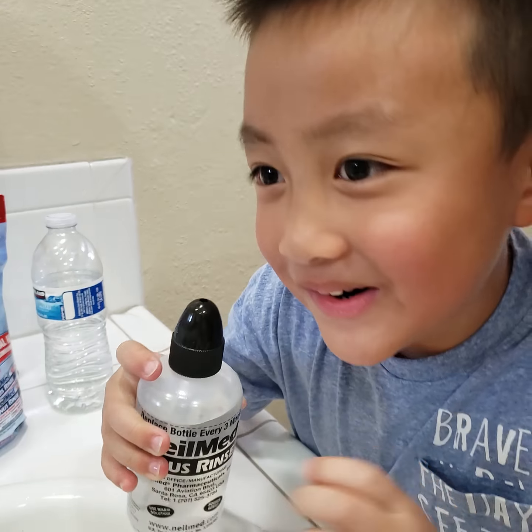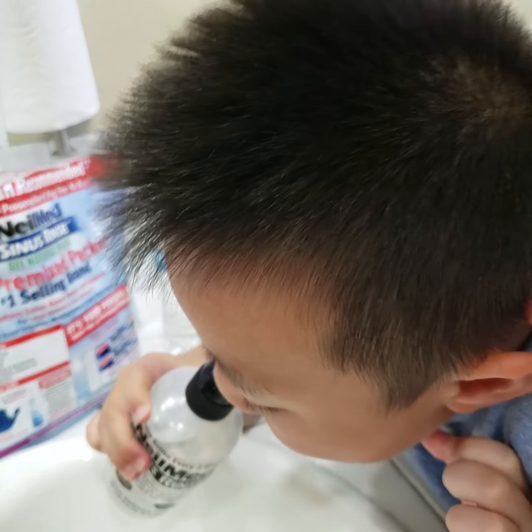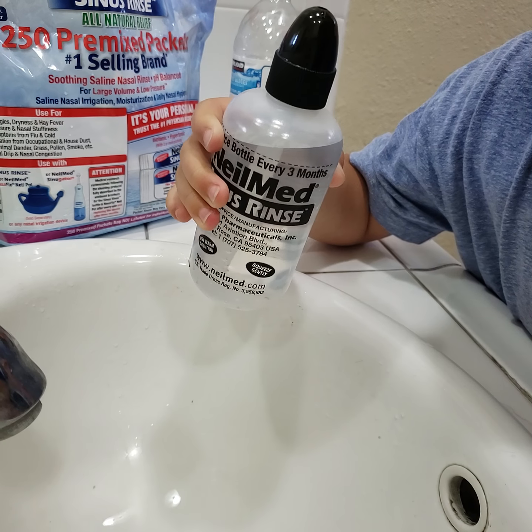No, no, no. I'm scared. You're scared. It's okay, come on, you got it. Okay, lean over. Open your mouth. Squeeze, squeeze, squeeze. I did squeeze. Okay, put it back in.